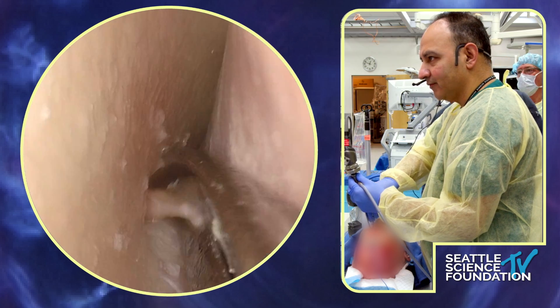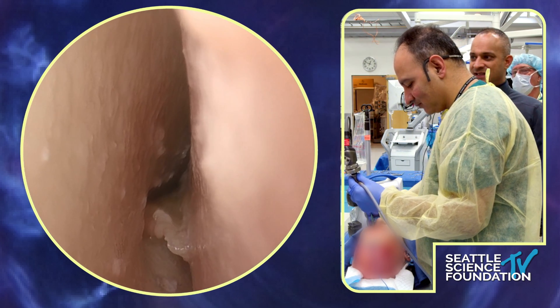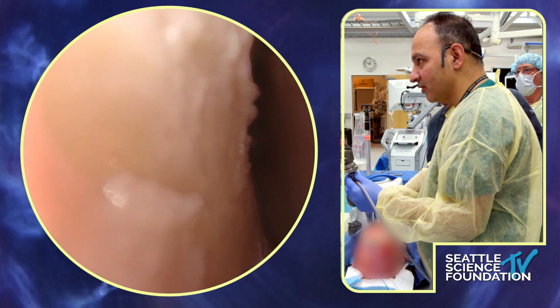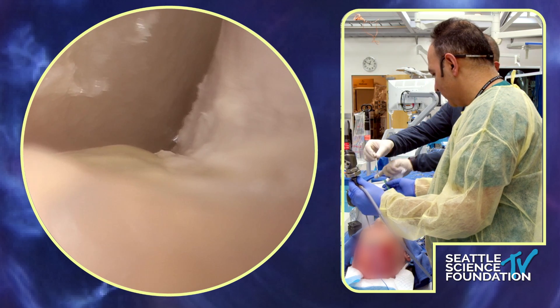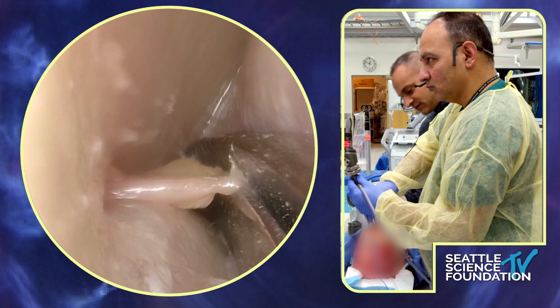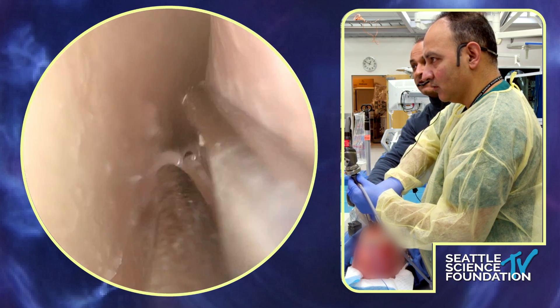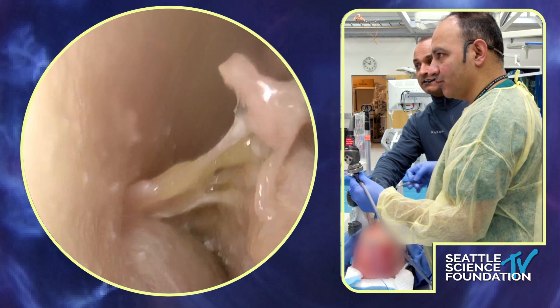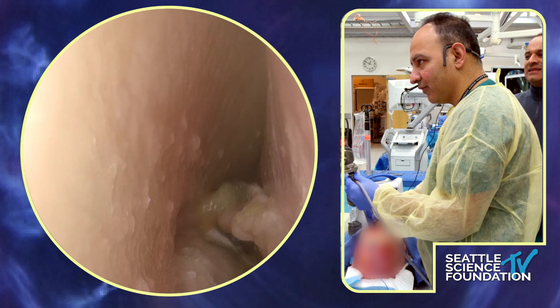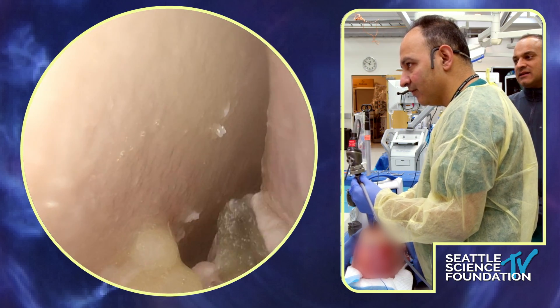Instead of cutting it, we're going to transect it with the scissors. There it is — now you can see the artery is separated in half. Let's go back with the cottle and work our way a little further to the next one. So that was the anterior ethmoid artery — remember it should be around 24 millimeters from the rim. Let's see if we go further back and find the posterior ethmoid artery. Oh, there it is — there's the posterior ethmoid artery coming in right there.